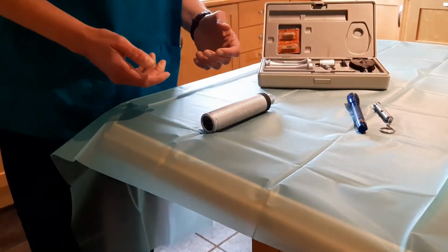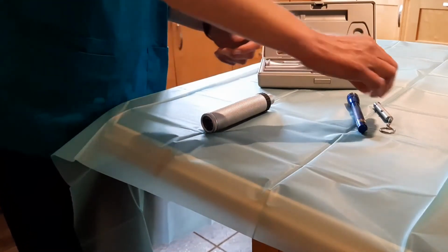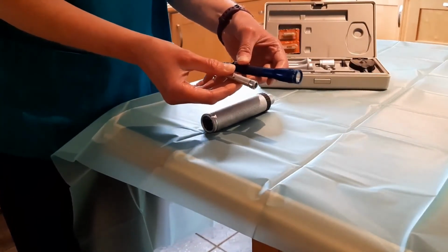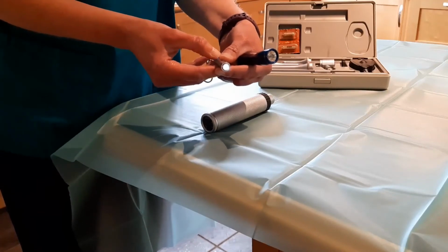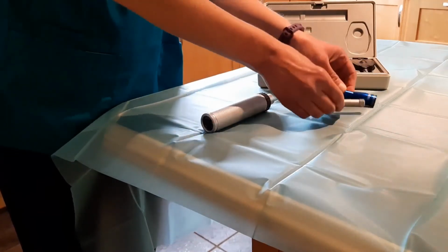Quite commonly as veterinary nurses, we really just want to check a pupillary light reflex. So what we need is a beam of light. So a simple way to do that is to use a pen torch. And this is just a battery operated single beam of light. So we'll press a button, emit a beam of light, and that will allow us to check those reflexes.